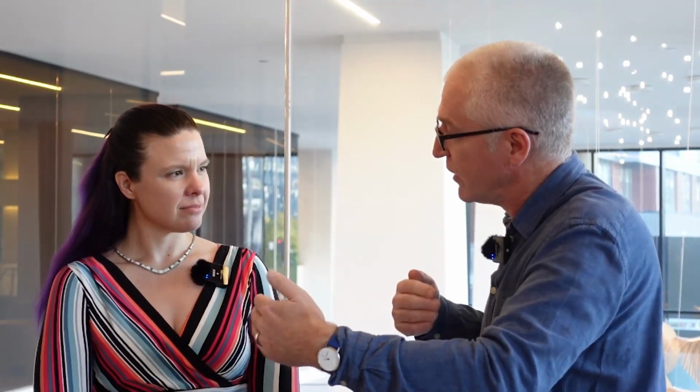So we go into that first, and we can then pull out what we think is probably the most likely clone. Sometimes we'll be lucky, we'll get, that's the one. It's got the best signal to noise, best sensitivity. And then we go through the process all over again. So that's that screening process down from 100 down to that perfect one. Right. And bring that into a full validation stream. And that full validation stream then is, if I remember right, 17 different cancer tissues.